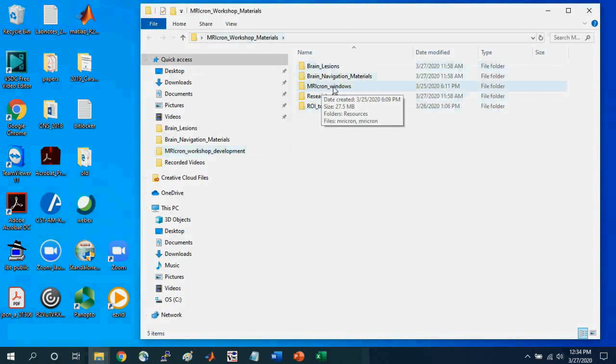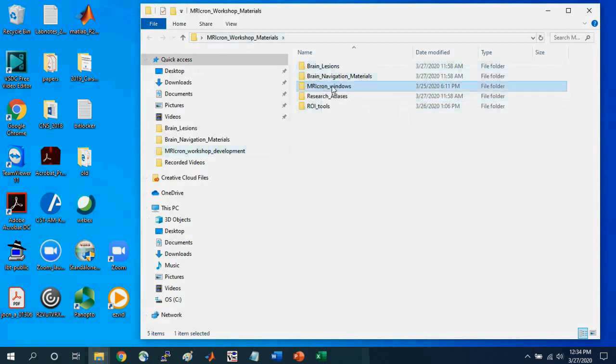They're the MRI-Cron workshop materials. Within it, you'll see these different folders. I've already downloaded MRI-Cron and put in this MRI-Cron Windows folder.